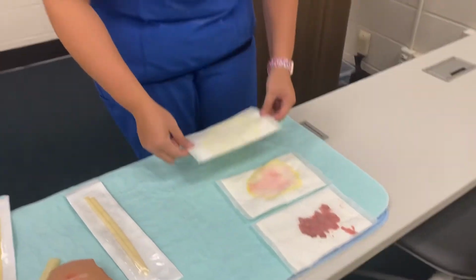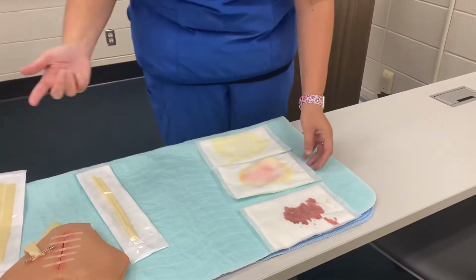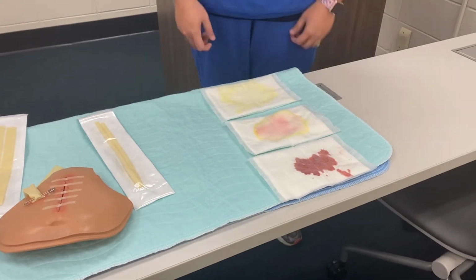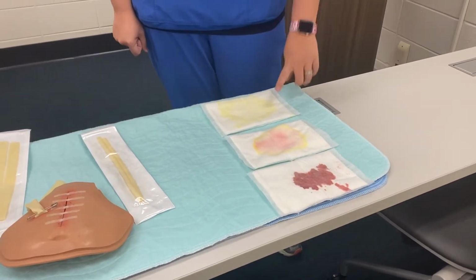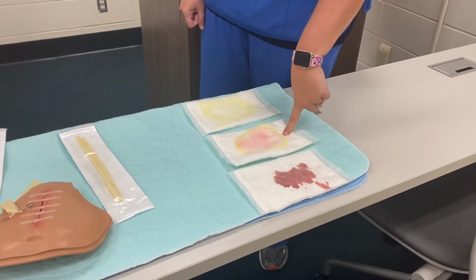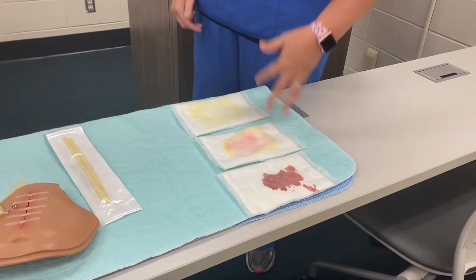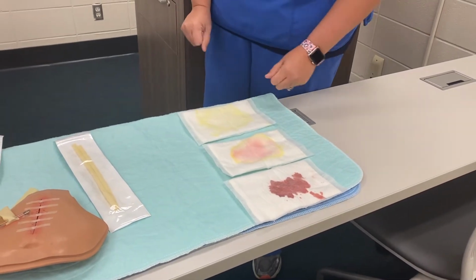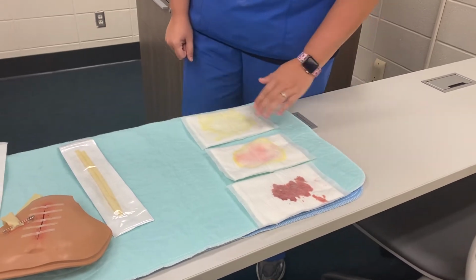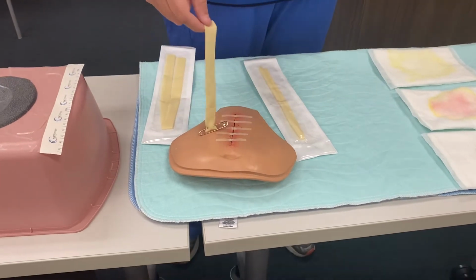So these are called ABD pads. So this wound would be on my patients, for example, if it's their abdomen, okay, I would remove it and I have to assess it. So remember in lecture, y'all talked about serous, sanguinous, and then serous sanguinous. So that just gives you a real life example of what those would look like on a dressing. So you can come in and just kind of remind yourself what each of these are called, okay? The next one we have here is our Penrose drain.